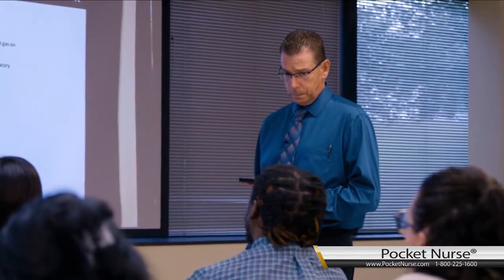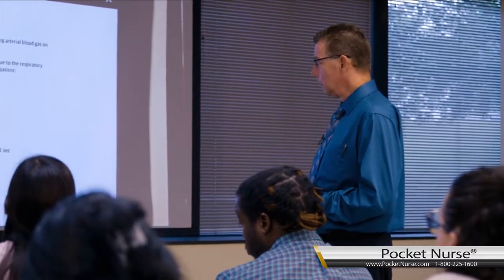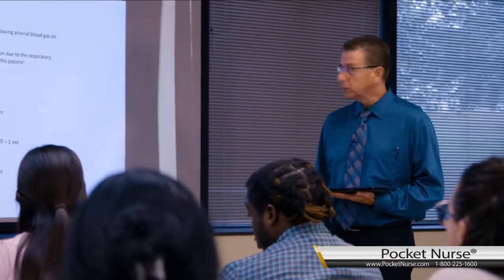Okay. Now, did the patient get better on the BiPAP? No. Their CO2 went up. Their saturations did, but that's it. Okay. So, with that update, do you want to leave them on BiPAP or would you like some new choices? New choices. Okay, Steve.